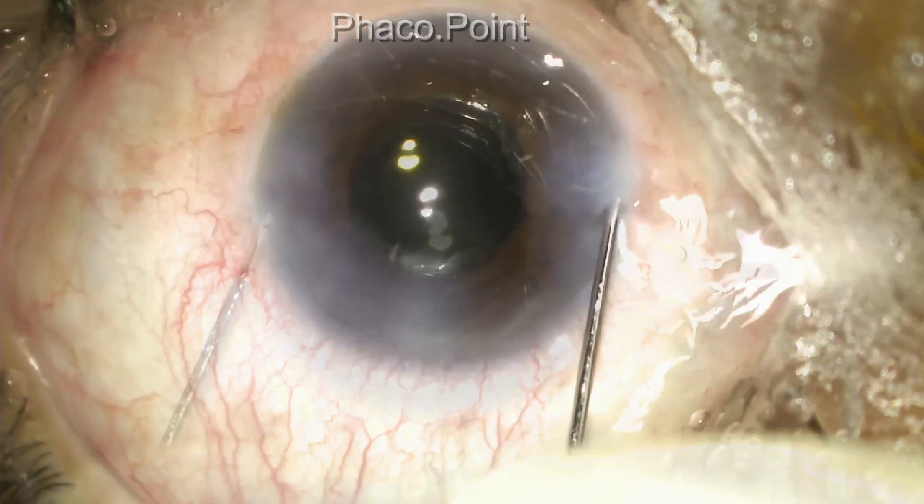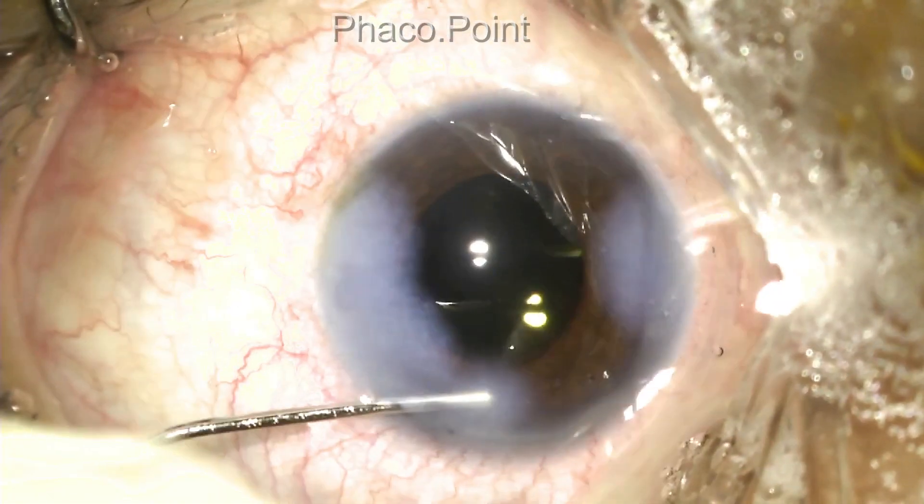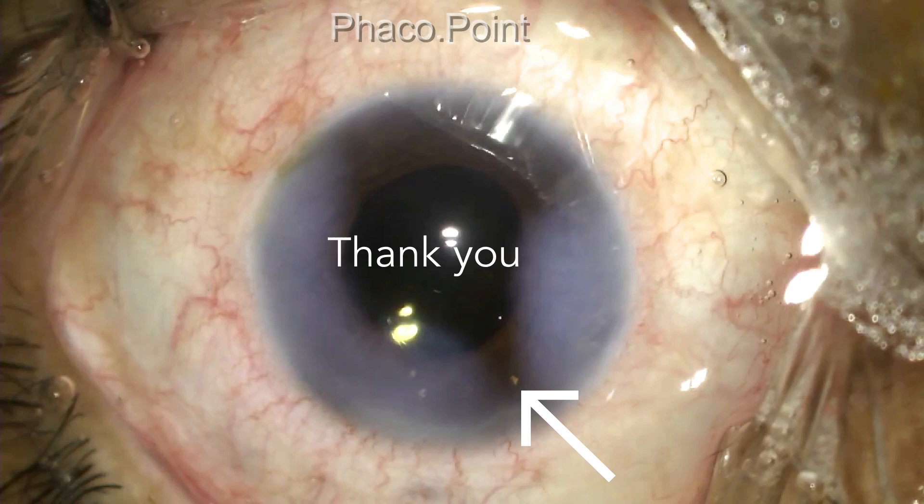The surgery is completed by performing a stromal hydration. And this, as you can see, is the end result.